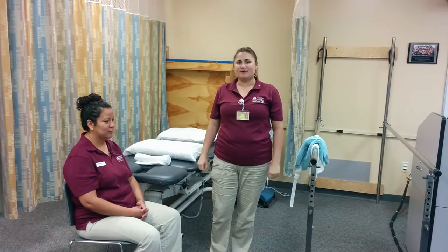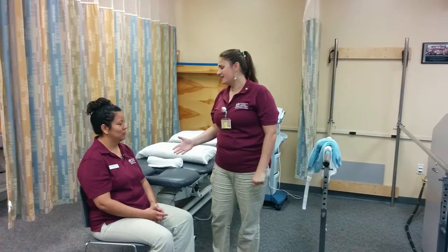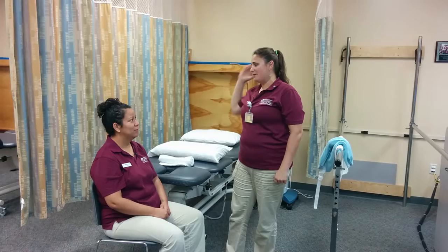This is my patient Anna. Anna, how are you feeling today? I understand you have a little bit of strain back here in your neck. We're going to increase your elasticity back there a little bit by applying a hot pack to your cervical.